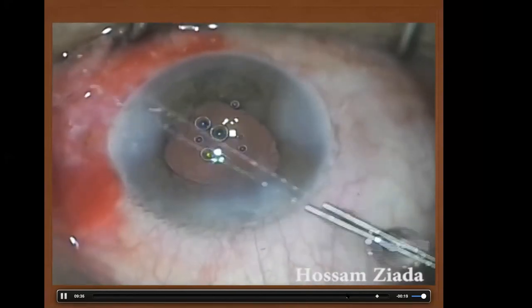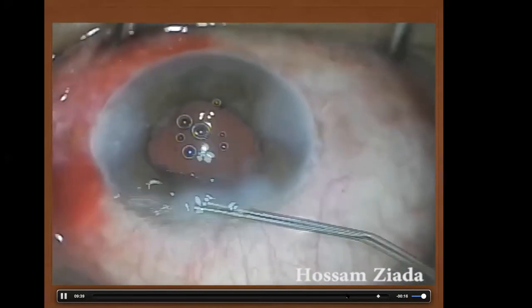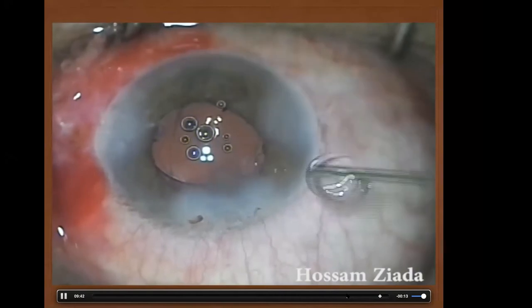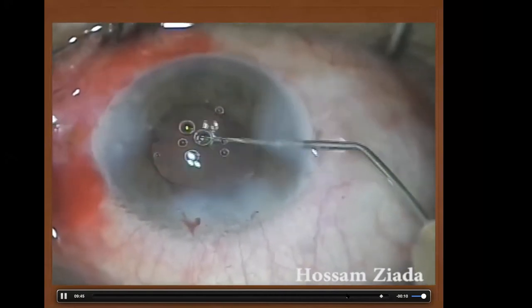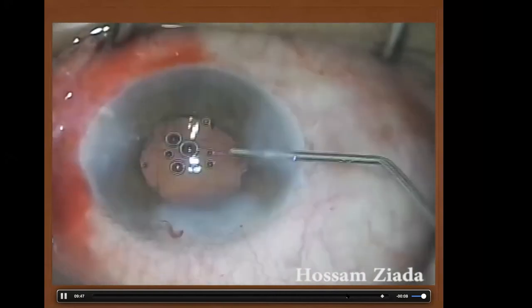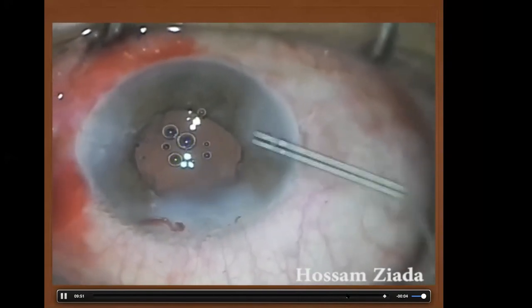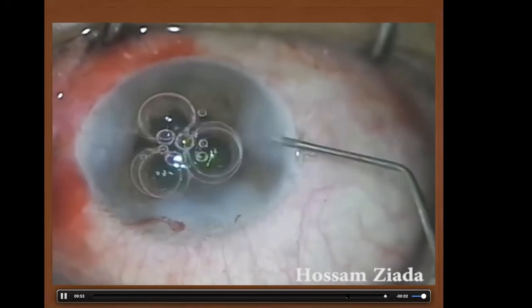Now it's almost clear or completely clear bag and the IOL in place, and I used to put my lovely air bubble at the end of the surgery to make sure that there is no vitreous prolapse, the pupil is okay and the IOL is supported, and thank you very much.